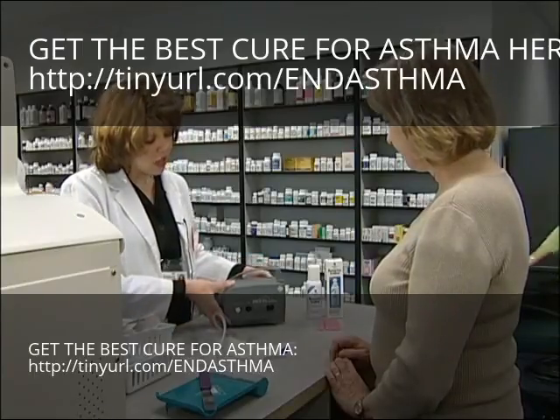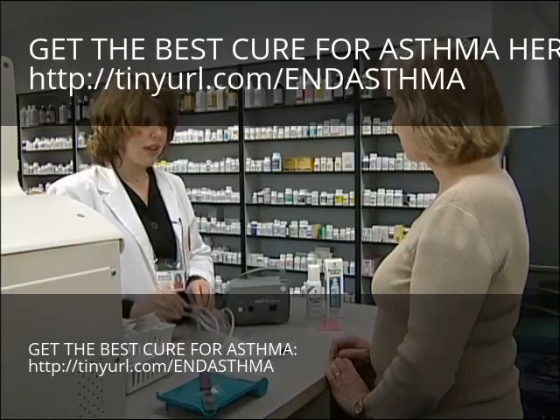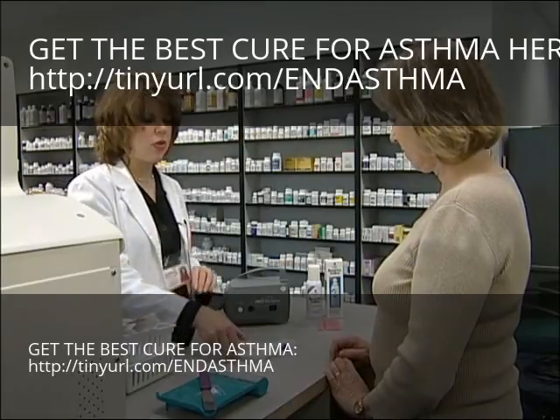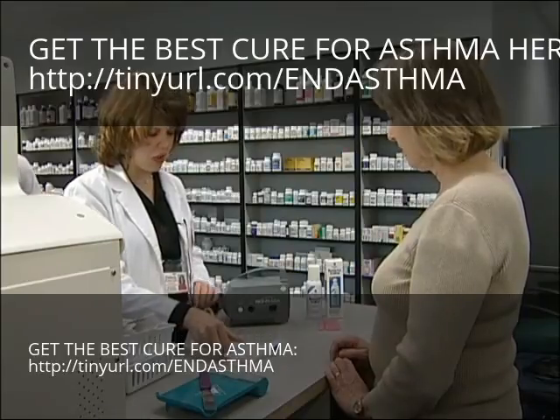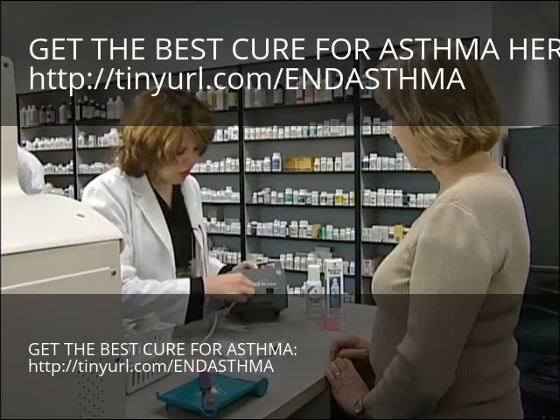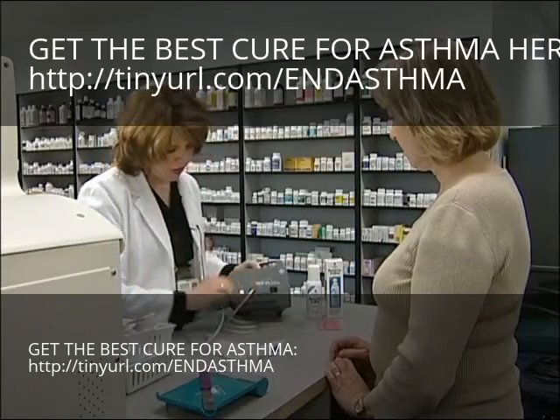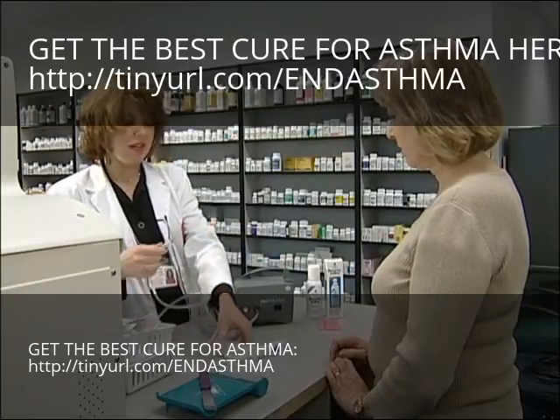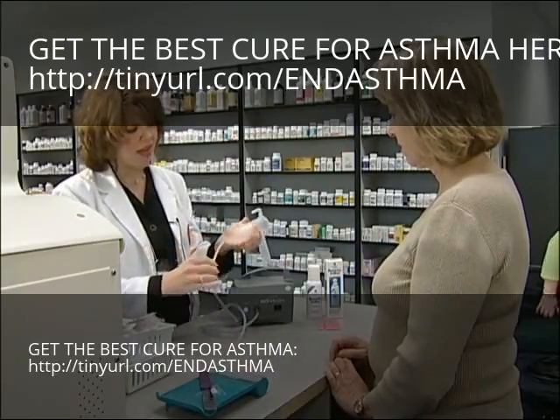It has this section which is the air compressor. Then you have tubing that you use to connect the air compressor to your medication chamber and mouthpiece. So there are three sections. The first thing you need to do is connect your tubing to this port here that says air. The second end of the hose needs to go to the medication chamber at the end.